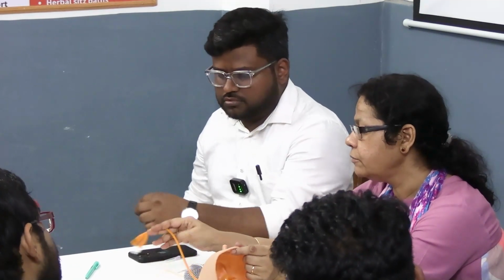Foley's catheter is self-retaining. It is retaining itself. You don't have to hold it for the patient. You can't hold it. So you push it in, put in the adequate amount of fluid that is written on the capacity of the catheter, and then you have to gently pull it out a little bit to see whether you are in the right place or not. So when you are inserting, the balloon should be inside. Do not inflate it before the balloon comfortably reaches into the bladder.